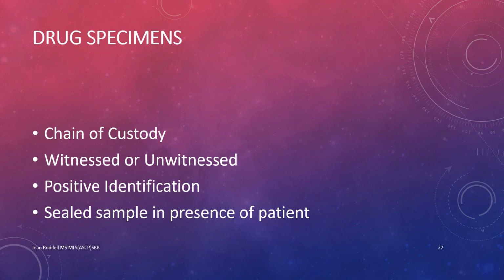Drug specimens. Urine specimen collection is the most vulnerable part of a drug testing program. Correct collection procedures and documentation are necessary to ensure that the results are those of the specific individual submitting the sample. The chain of custody is the process that provides this documentation of proper sample identification from the time of collection to the receipt of laboratory results. The chain of custody is a standardized form that must document and accompany every step of drug testing, from collector to courier to laboratory to medical review officer to employer.